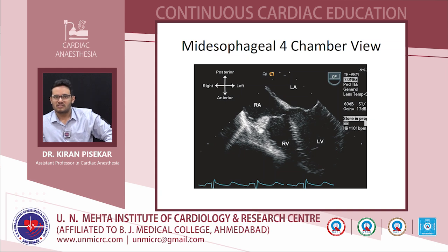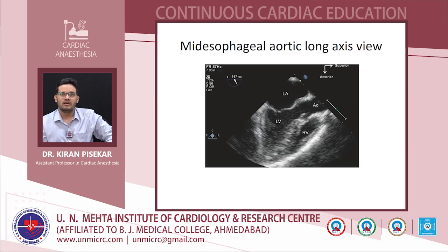So in just one view we can assess the regurgitations of the mitral valve and tricuspid valve. We can also assess the function to a great extent, and other findings like any VSD or any ASD.